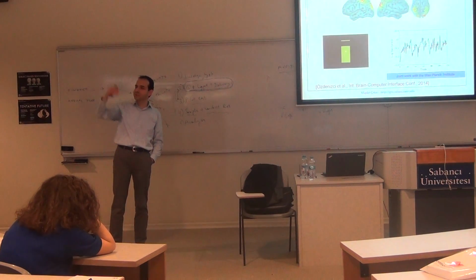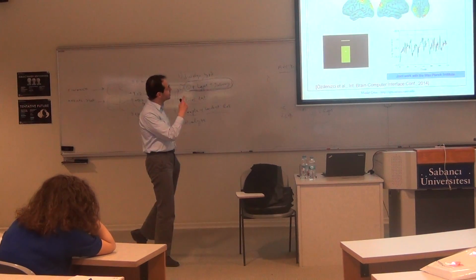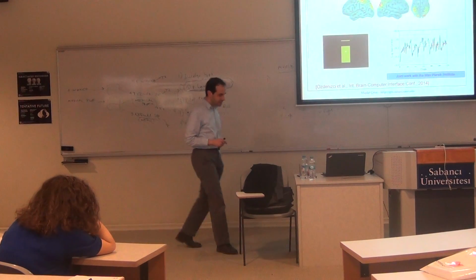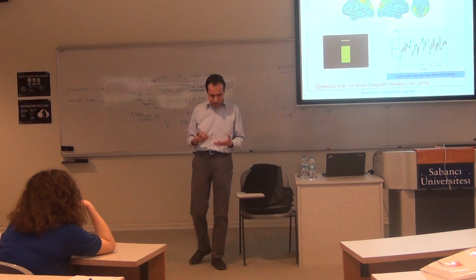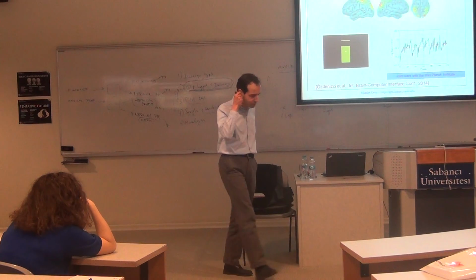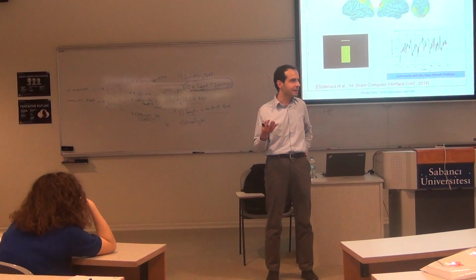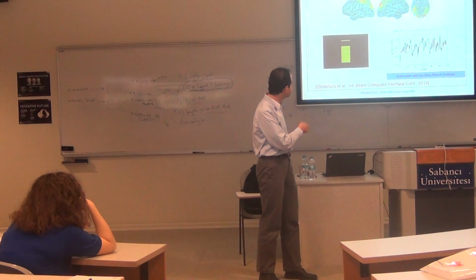And then another one, Ozan's master's thesis here, and this is using what's called neurofeedback. So in my robotic rehabilitation work, I mentioned this idea of having stronger motor imagery. But this work is taking a deeper look into that question. So you can ask the question, when a subject suffers stroke, what type of brain activities are suppressed or damaged? So you can first measure that.